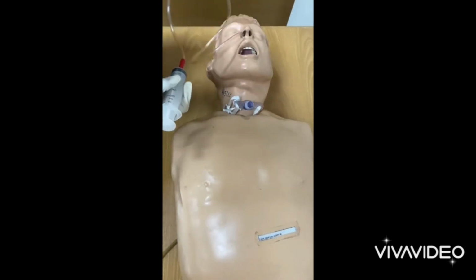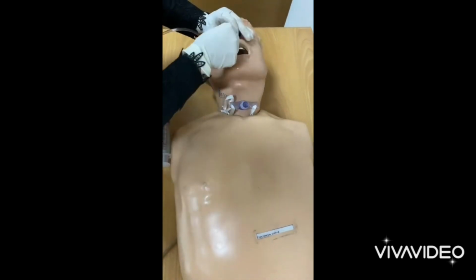Next, you have to secure this tube with the help of a tape to the nostrils.